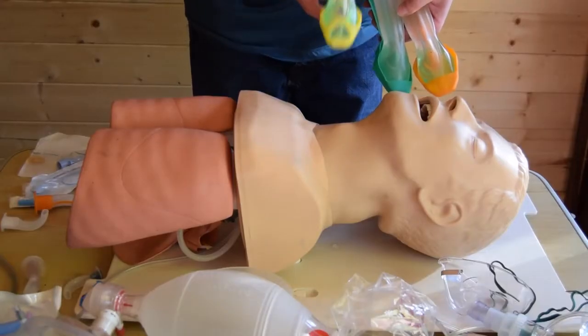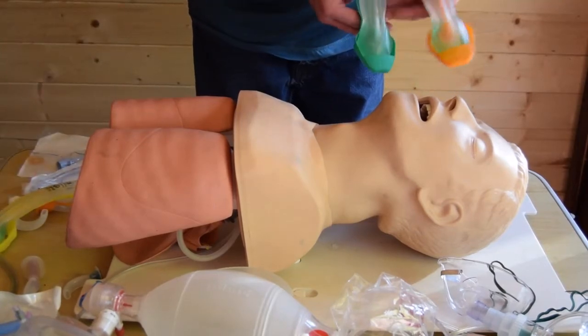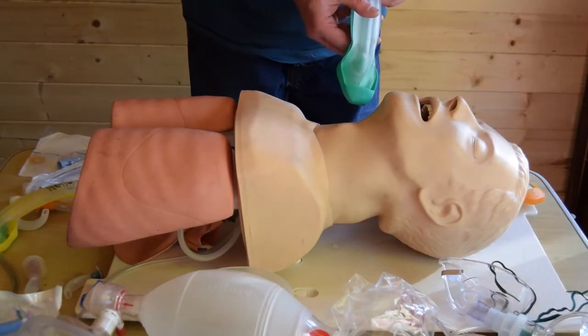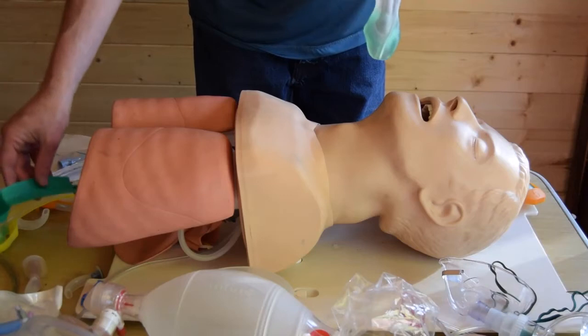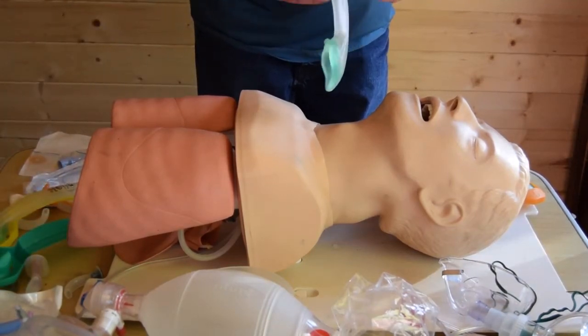So the smaller one is for 30 to 60 kilos. The larger one is for 90 plus kilos, and the one that fits most people, most adults, is the 50 to 90 kilo variety. You should aim to put in the largest airway you can fit that will comfortably fit the patient.